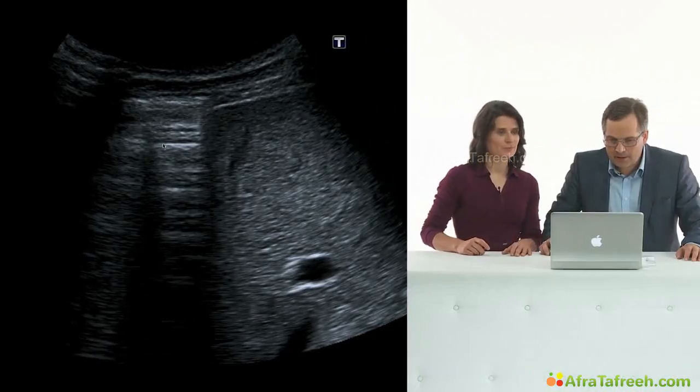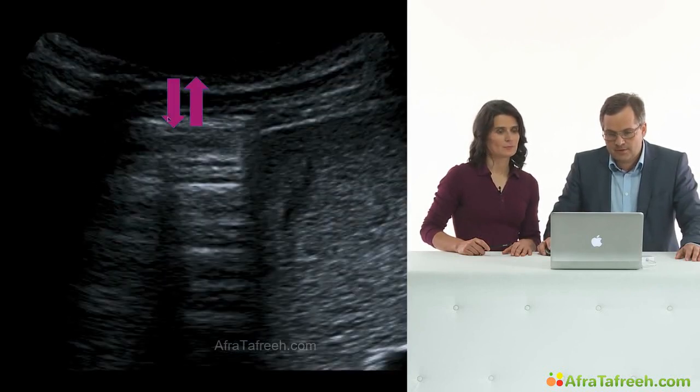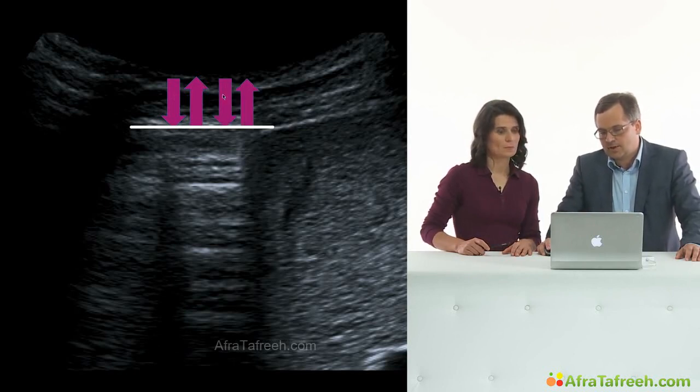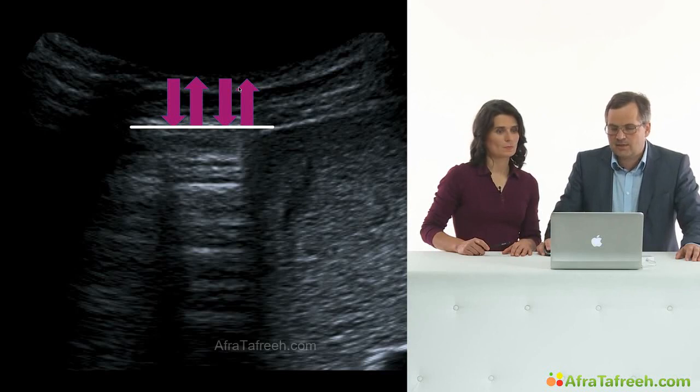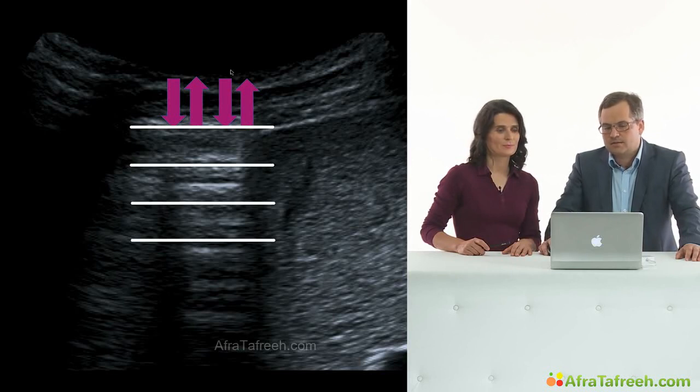There are multiple high hyperechoic echoes in this area, and over there it's more cranial to the liver. We see gas, air in the lung, so we have repeating echoes over there, and the sonic wave is reflected in this level, touching the lung surface, is reflected towards the skin of the patient, is once again reflected towards the lung, and once again to the skin of the patient, and at last it enters the transducer.